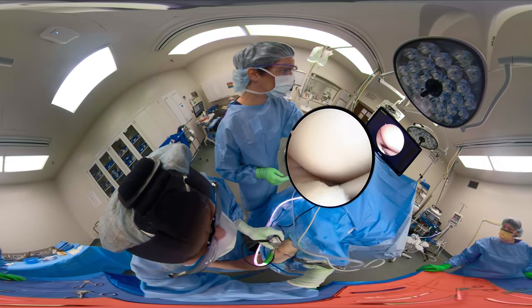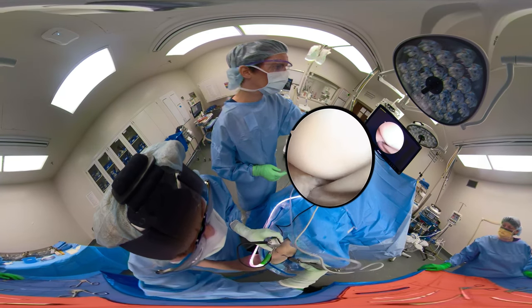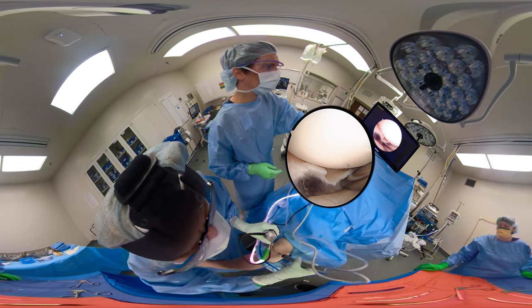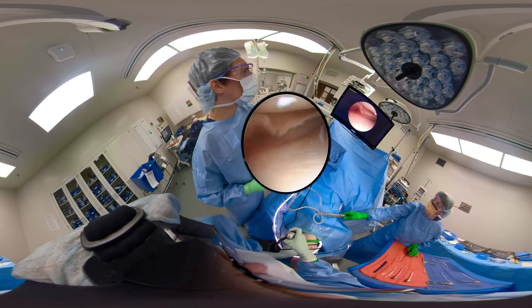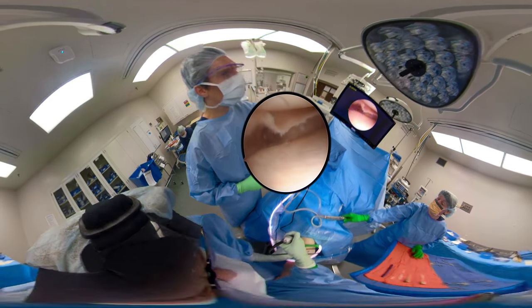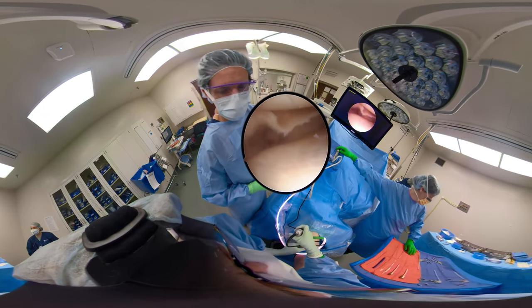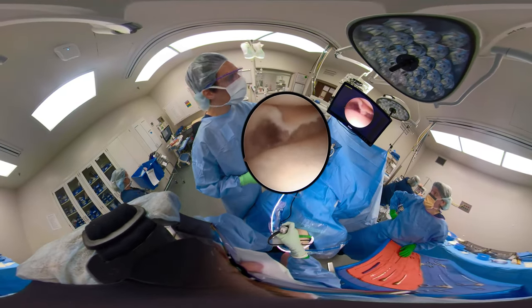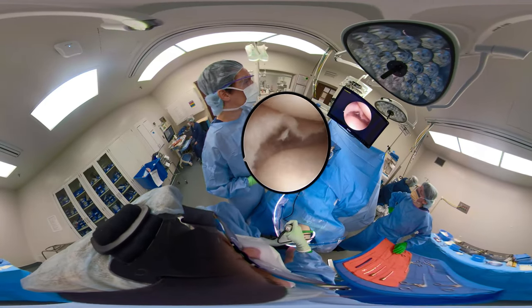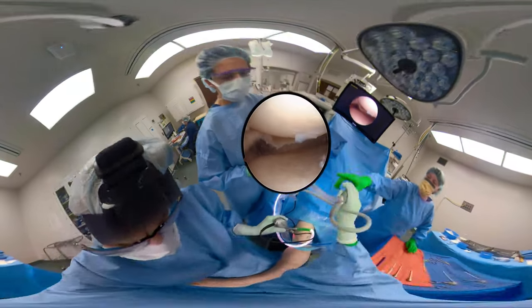A little different view of the meniscus tear. We're looking to see if there's any swelling where the cyst is, and we just did a needle trephination of that. I've got a needle in the medial side over where the cyst is and we're trephinating this. There's a small capsular rent where the fluid would leak from the meniscus tear out into the ganglion. We can use a needle to trephinate this ganglion cyst, and we did not do an excision.